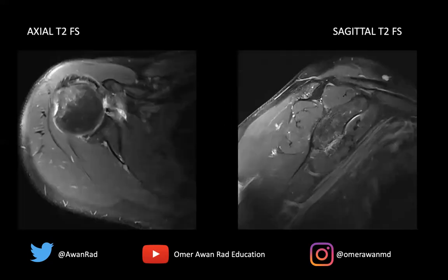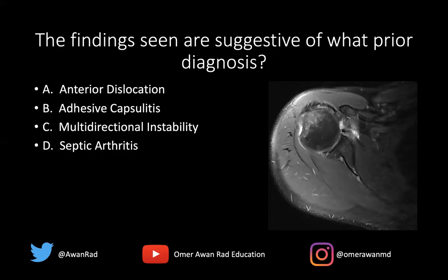I want to come back because I think the sagittal is also telling for what we're trying to see here. So what prior diagnosis do they have between these four? The answer here is an anterior dislocation — anterior glenohumeral dislocation.